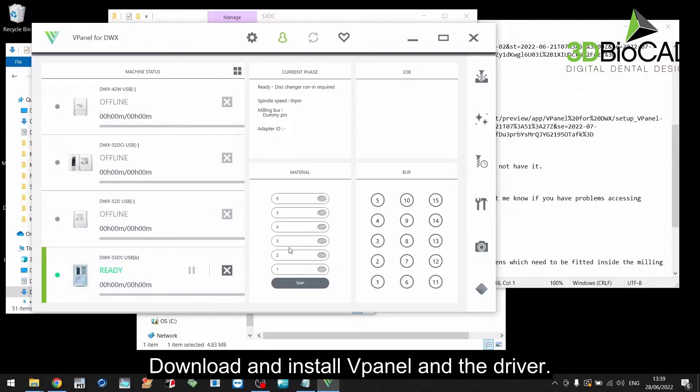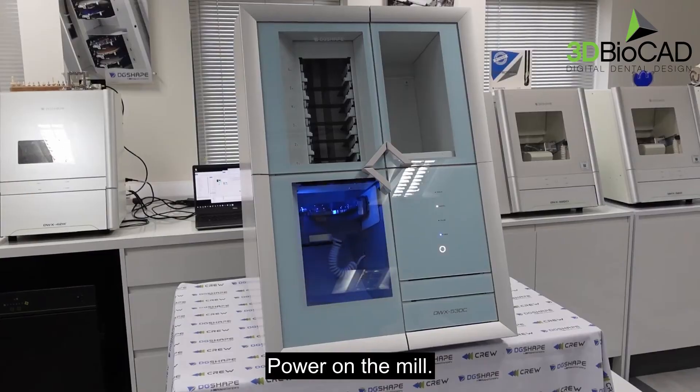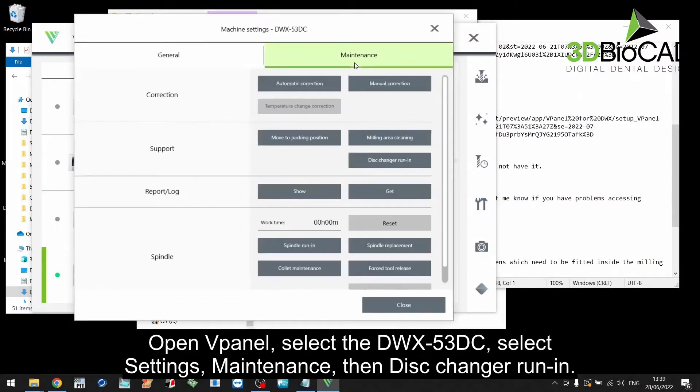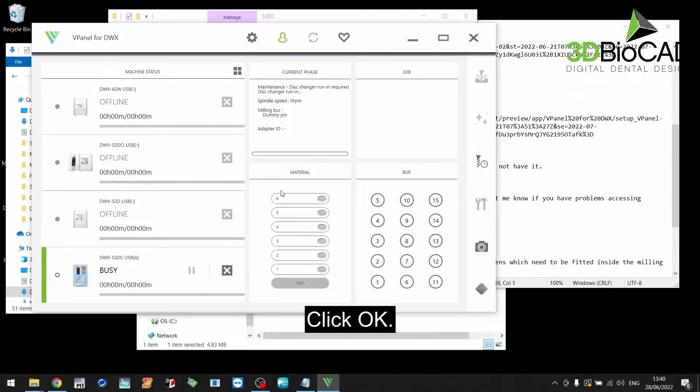Download and install v-panel and the driver. Power on the mill. Open v-panel and select the DWX53DC. Select settings, maintenance, then disk change run-in. Click OK.